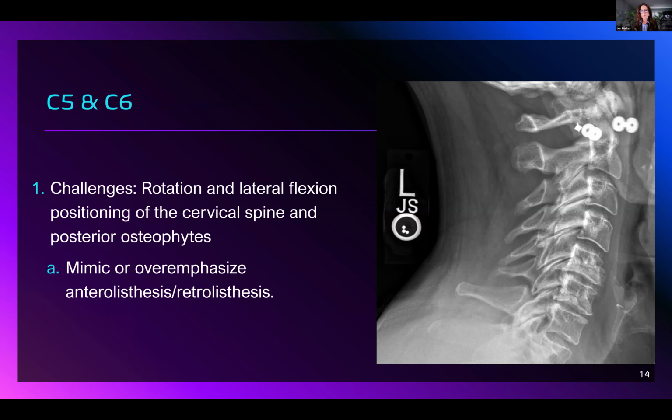Yeah, the rotational, echoing back to what you were going to talk about with alar ligament. I do see more, and not always, but sometimes I do see more upper cervical spine involvement. In particular, we see that with the alar ligament, because you get a side impact and then you whiplash off laterally. So if you're bending to the right, it's the left alar ligament just trying to hold on, and then it gets torn. Then on these AP open mouth views with right and left lateral bending, we can see the lateral mass bypassing the margin of C2, and then we know there's alar ligament injury.